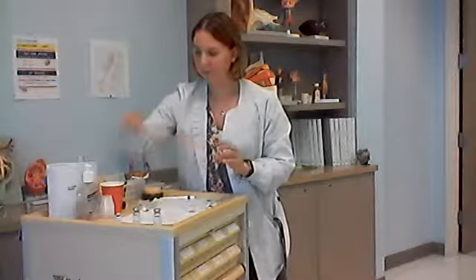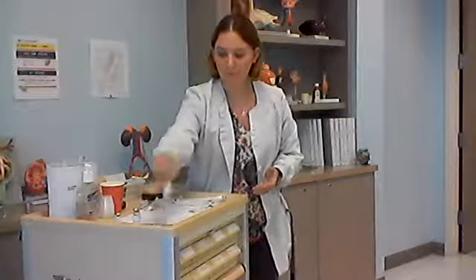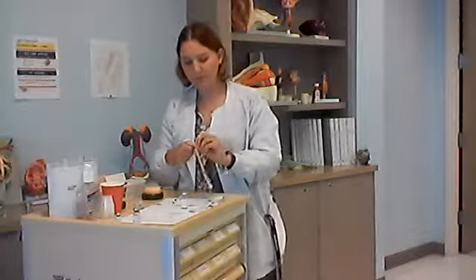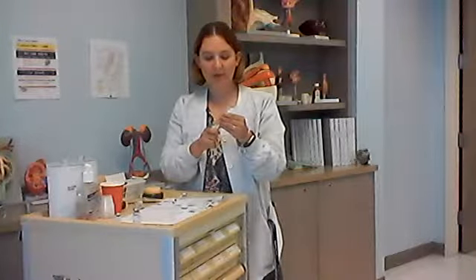Okay, now I'm going to prepare my medications. I'm going to get an alcohol swab, my syringes, and some labels. I'm going to begin with my heparin. I know I need 0.5 milliliters. I have the correct syringe. I'm going to draw back 0.5 of air.